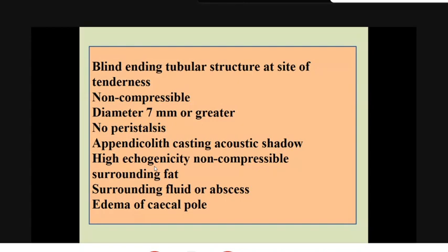ليش احنا نقول graded compression technique؟ شنو يعني هو graded compression technique؟ The graded compression technique is that we use a pressure when examining the patient. This pressure is gradually increased over the area.